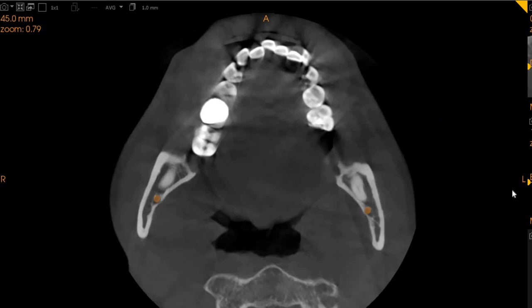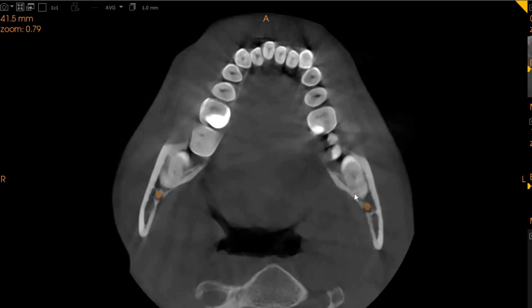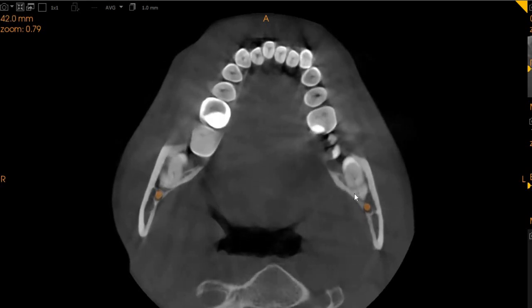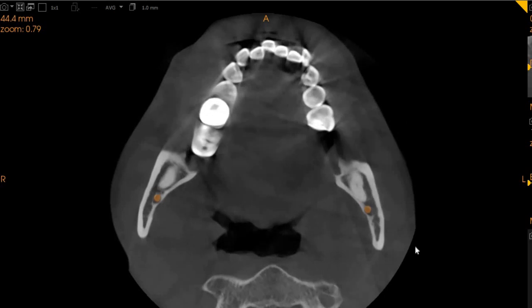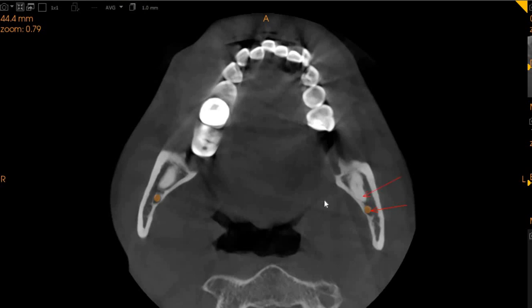This is the axial view, which is basically the top to bottom view. On the axial view, we can also see this is the left-hand side. The apical part is close, but it's not as close to the inferior alveolar nerve. And we've got a significant portion of the mandibular bone between the canal, which is right here, and the apical portion of the tooth, which is right here.